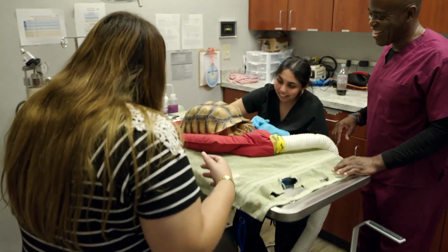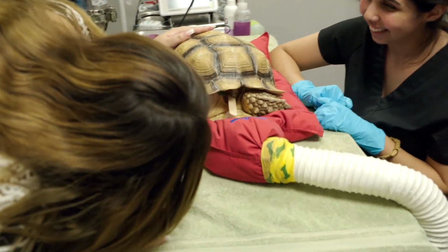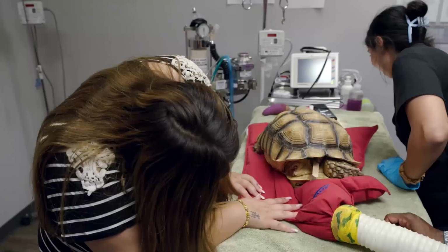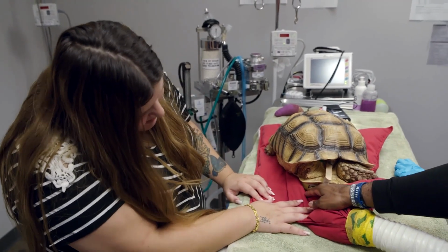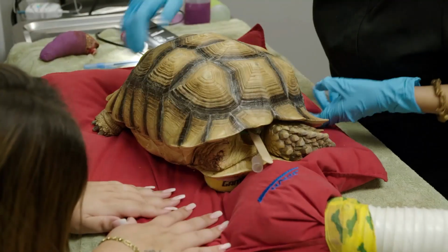Hi, my girl. Maybe she'll hear your voice, that might wake her up. Hi, sweet girl. Oh, my baby. She's got a little prosthesis and see how it kind of elevates that shell. Yes. Do you think it'll have issue against concrete? No, because this slides. It slides great. Absolutely. Yep. This looks fantastic.